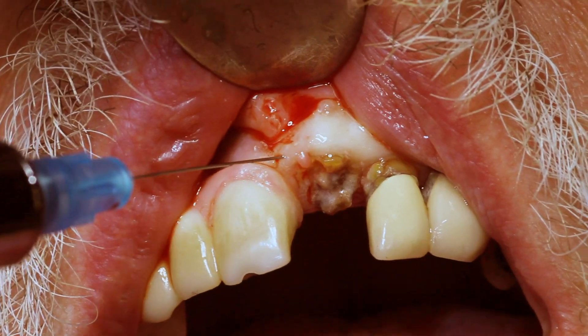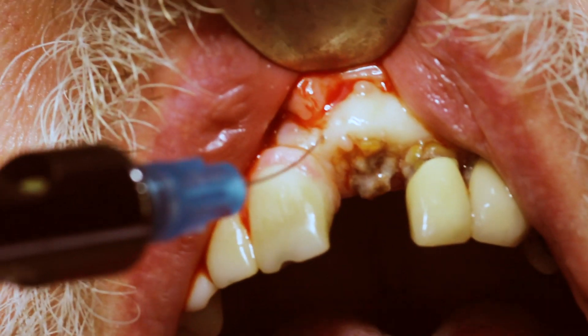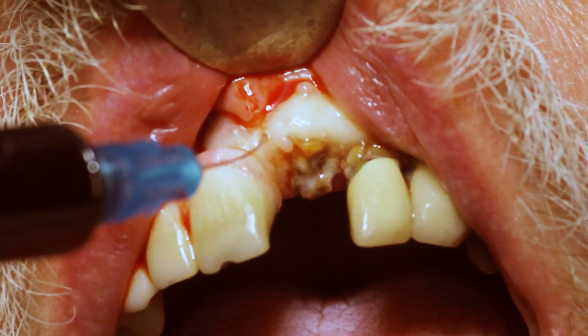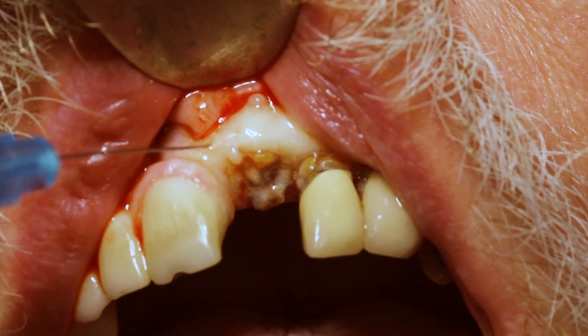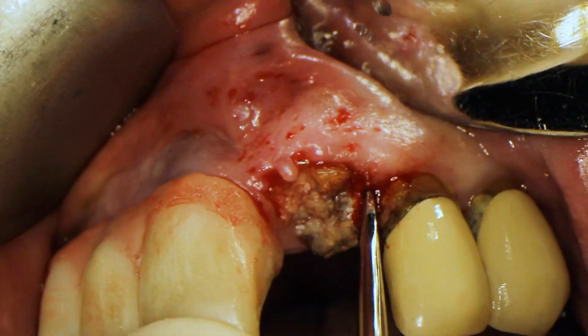First I'm getting the patient numb — I applied some topical and I'm going around the tooth to be extracted, doing small local infiltrations with septicaine.